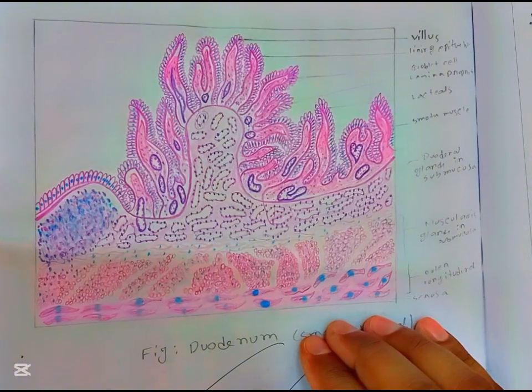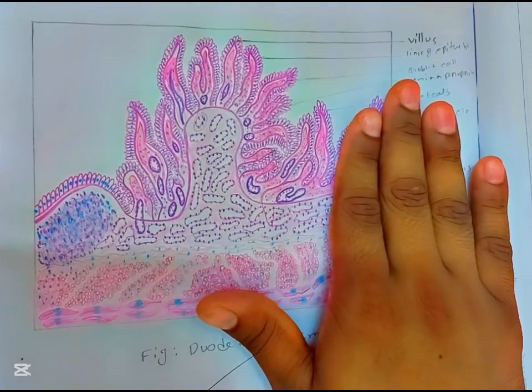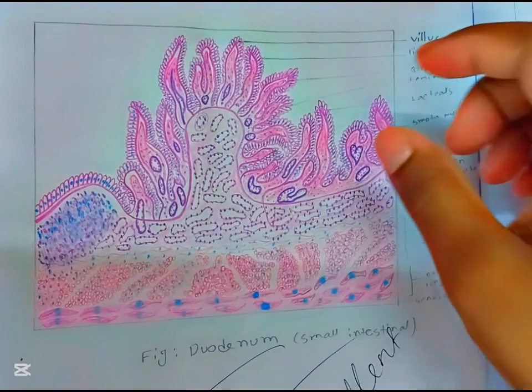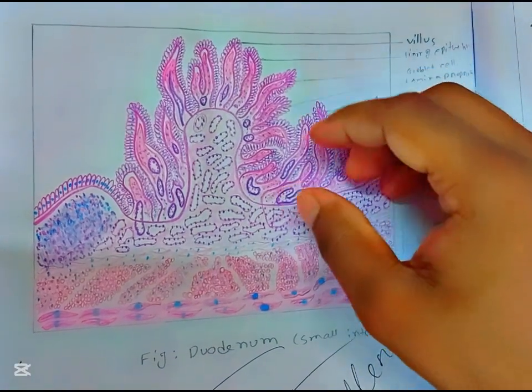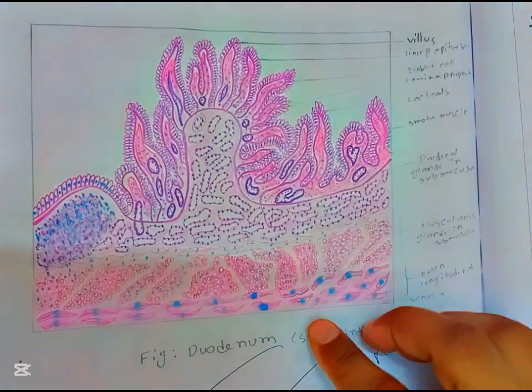The first part of the small intestine is the duodenum. This is the histological figure of duodenum. It also has 4 layers. First of all, mucosa, submucosa, muscularis externa, and serosa.